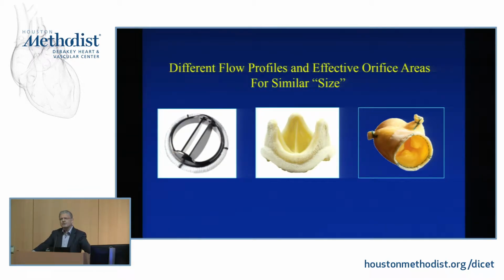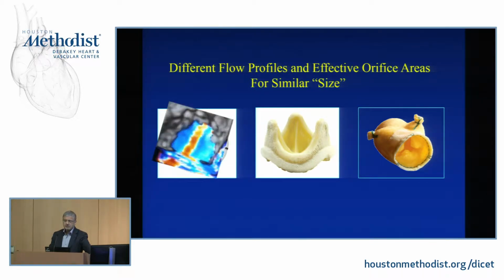Point number two, which is not as dramatic, is that depending on the type of valve that you have, it may alter the signal of your non-invasive way of imaging, particularly with Doppler. And what I'm talking about is the bileaflet valve prosthesis, where there is basically a higher velocity across the area between those two leaflets. And that has been demonstrated in vivo, in vitro, you name it. What does it mean? It means by Doppler, since you cannot differentiate the velocities among these orifices, that your determination is that of the highest velocity.